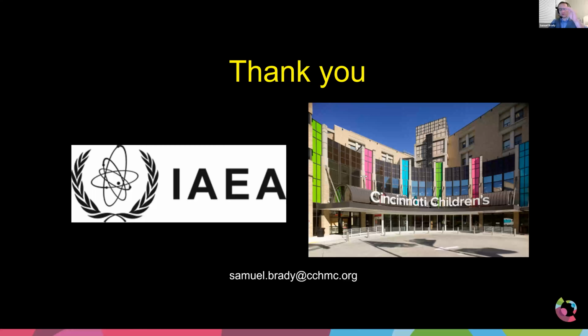It's just really important that we look at it holistically so that we can get all of that in the right order. And at some point you're going to have to go through your protocols one by one. Let's focus on chest. Do we like that they're all 5 millimeters? Should we have one set of fives and one set of 0.5s? Do we like the overall image quality? Is there too much noise for what we're doing? Should we lower our kV?